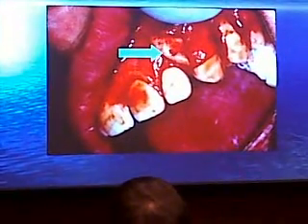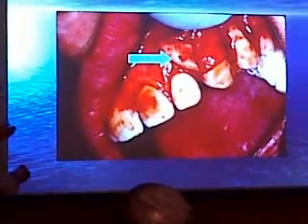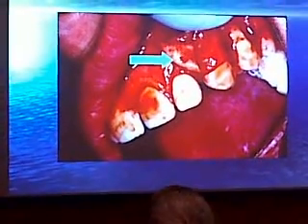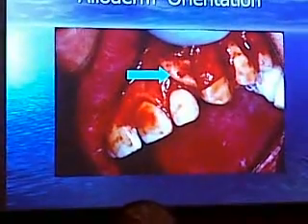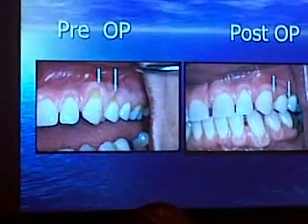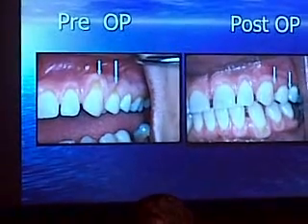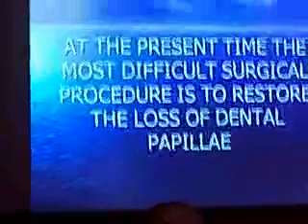When you use the cadaver collagen, you put on the blood. The side that absorbs more blood, you want that side to be toward the tissue, not toward the exposed. So we place it and suture it, and then here's the corner. All right. Very nice. Do you get the best result with human tissue, with the patient's tissue? Obviously. But that's an alternative. Okay.